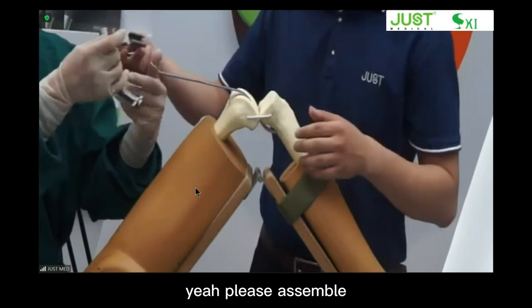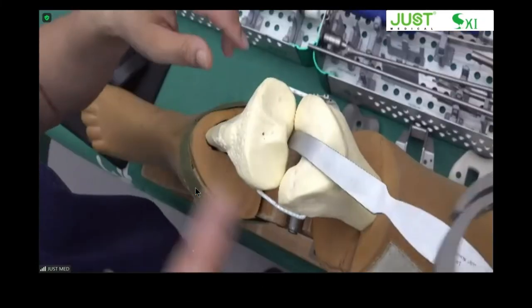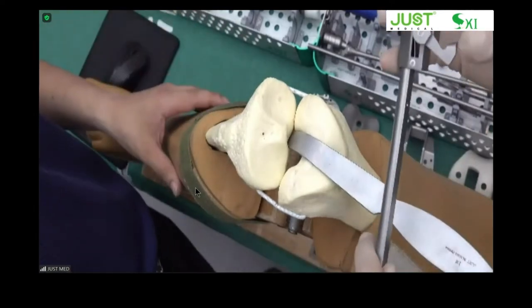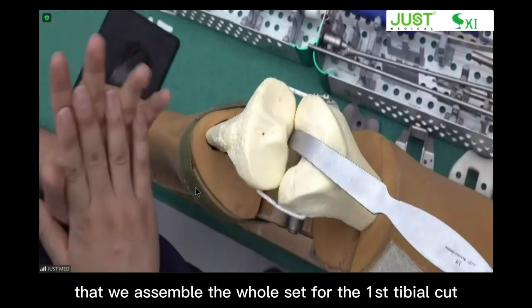Yeah, please assemble all those components. We assemble the whole set for the first tibial cut.